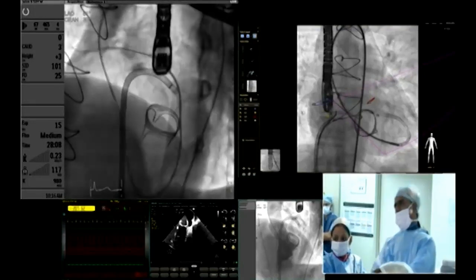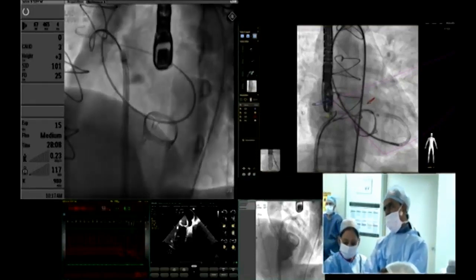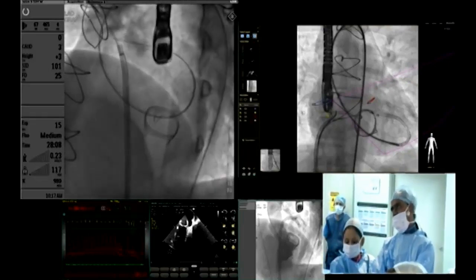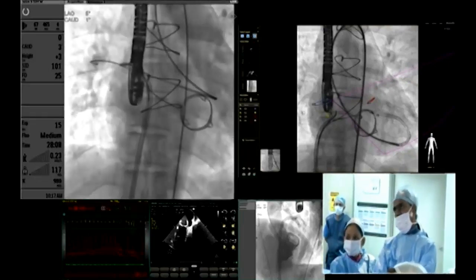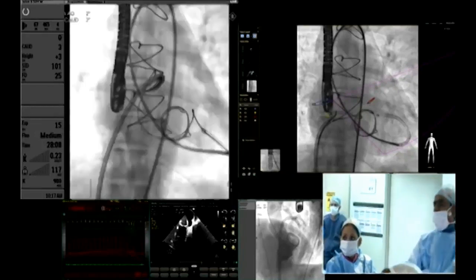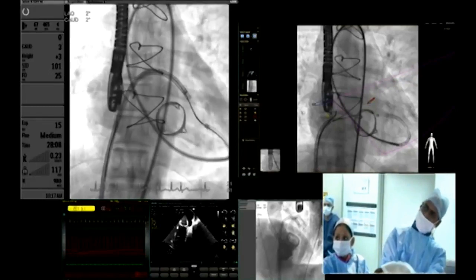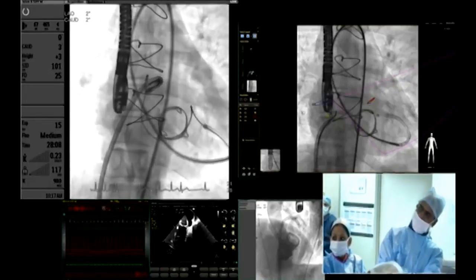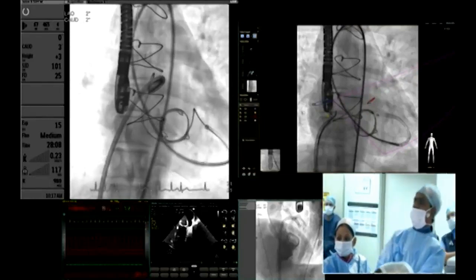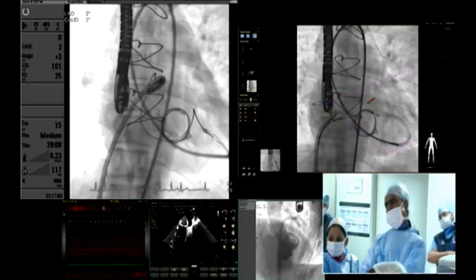We then snared the wire and created an arteriovenous circuit. One very important thing: while trying to snare, always have the catheter across the defect, because if you just snare the wire it can tear through the defect and can enlarge it. Once you are snaring, you have to keep the defect protected by the catheter — otherwise it can lead to a cut-through effect.